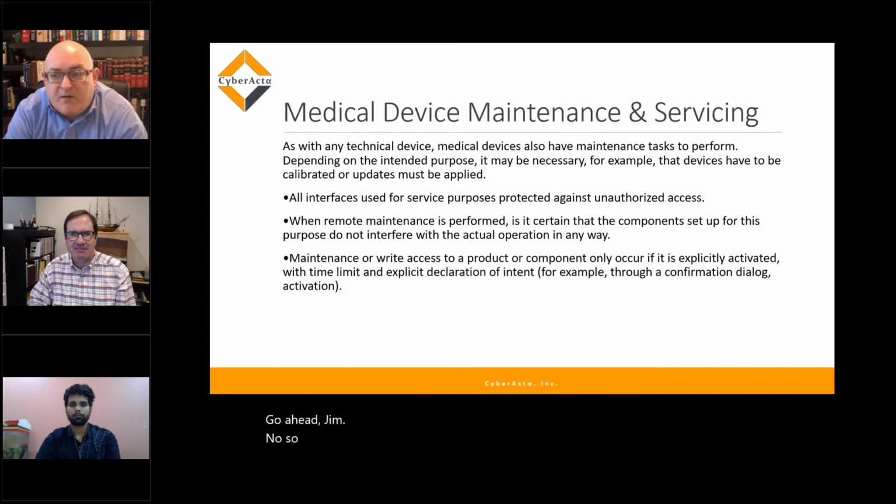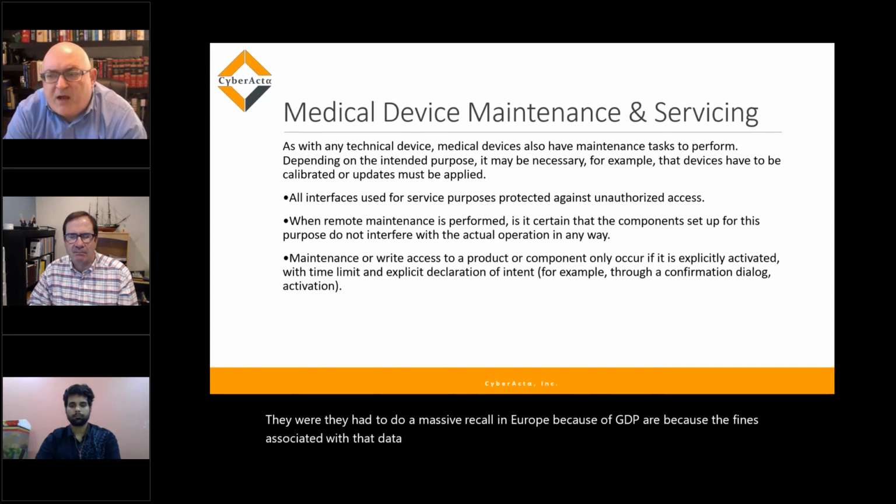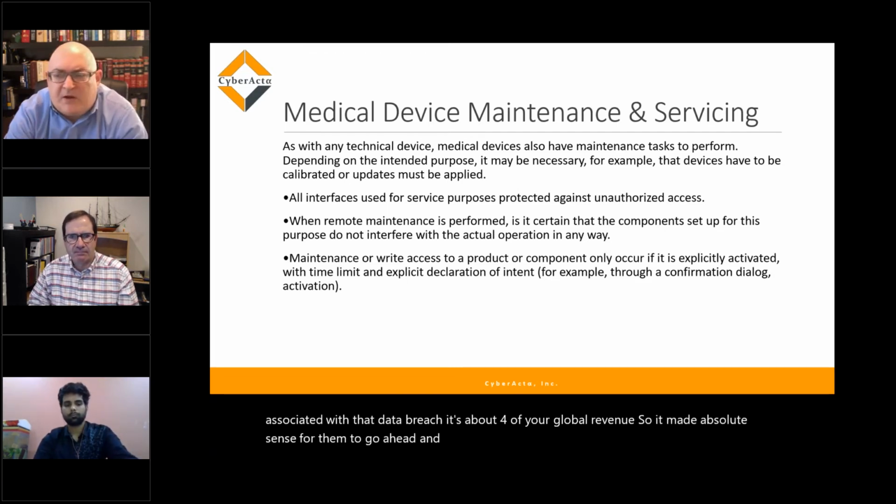So that was one of the recent recalls where they had to do a massive recall in Europe because of GDPR, because the fines associated with that data breach are about 4% of your global revenue. So it made absolute sense for them to pull or address that particular vulnerability out of their system. Go ahead, Jim.